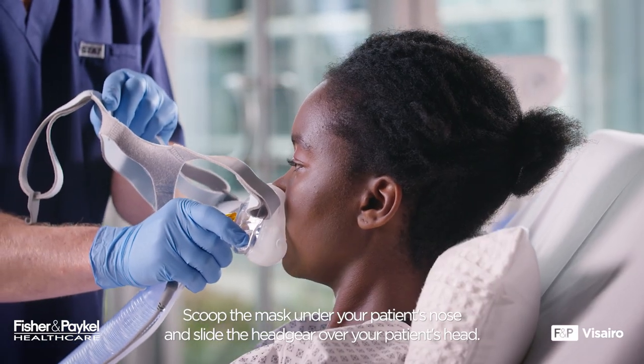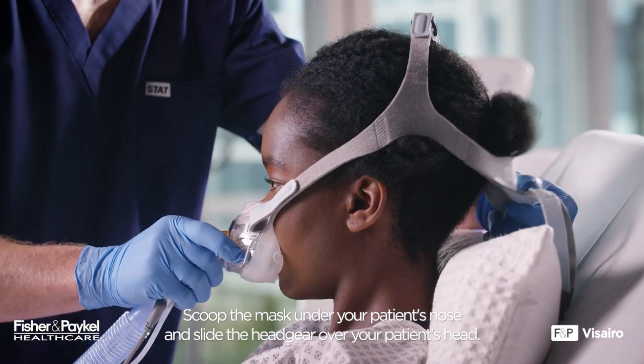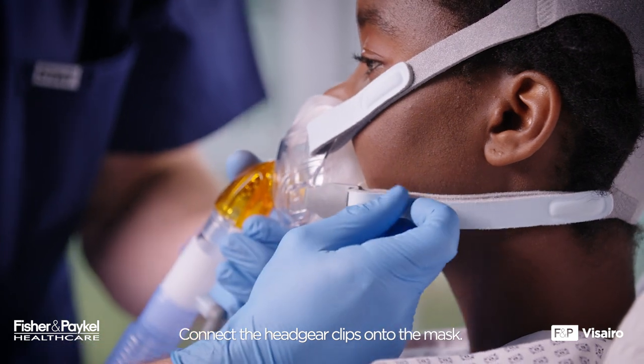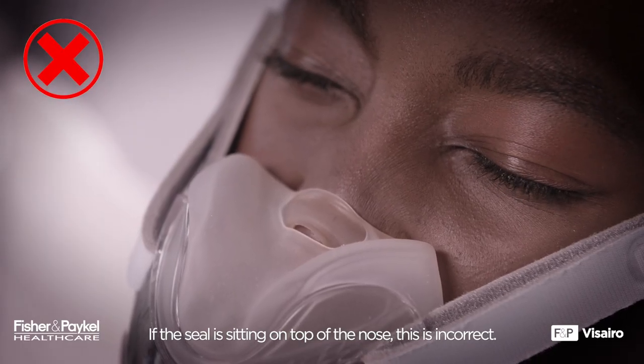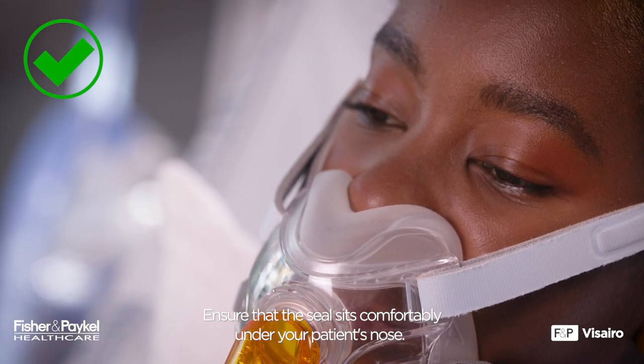Scoop the mask under your patient's nose and slide the headgear over your patient's head. Connect the headgear clips onto the mask. If the seal is sitting on top of the nose, this is incorrect. Ensure that the seal sits comfortably under your patient's nose.